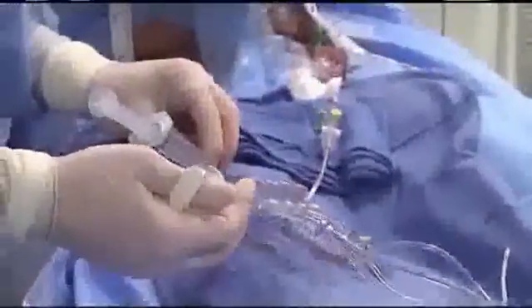So we have a dual injection now. We have access with 6 French on the right and left common femoral, and I have a 20 cc syringe, so we will do simultaneous injections as we use this as our measurements for our placement of our stent.